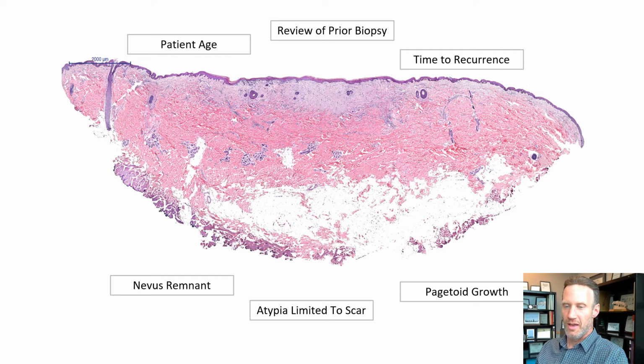The bottom line is that whenever possible, every effort should be made to examine that initial biopsy in a case like this. Beyond that, age of the patient is often very helpful information. In a young patient, even when the histopathologic findings suggest melanoma at first glance, traumatized or recurrent/persistent nevus almost always warrants at least some consideration. But in this case, while the patient's age alone probably shouldn't completely eliminate all consideration of recurrent nevus, it should significantly raise suspicion for melanoma.